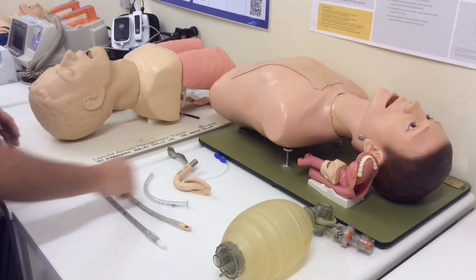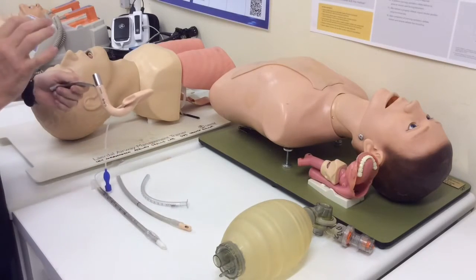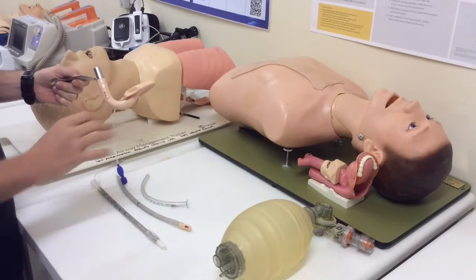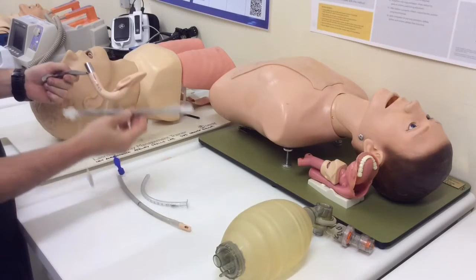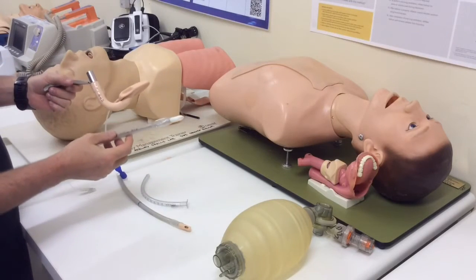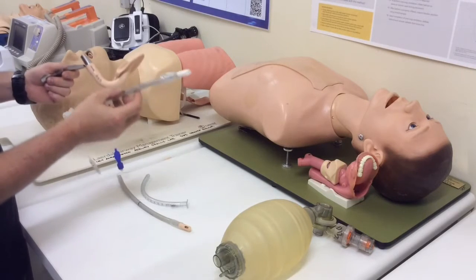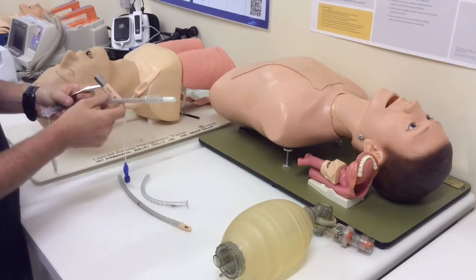So, the Fastrach is a device which is designed to allow one to obtain an airway using the supraglottic airway in a difficult intubation situation, and then intubate through it blindly using a specifically designed endotracheal tube. It's important to recognize that using the Fastrach's own endotracheal tube has been shown in the literature to have a better success rate than using any old tube, because of the way that it's tapered, because of the way that it's designed.